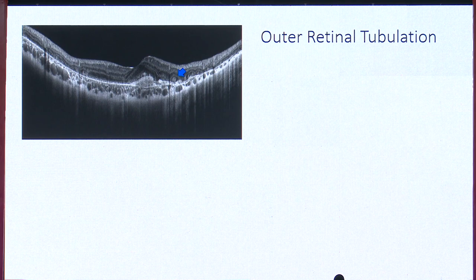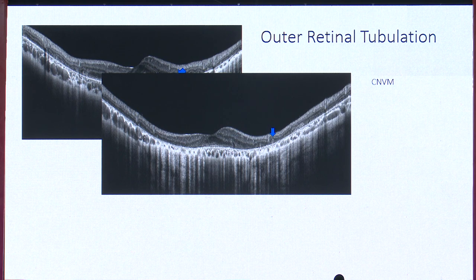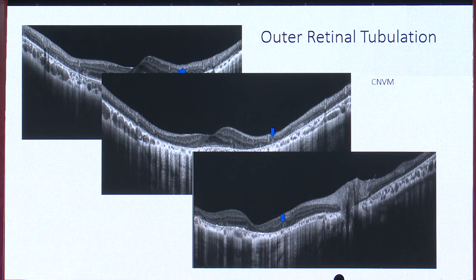Outer retinal tubulations are hyporeflective spaces lined by hyperreflective ELM, mostly described in AMD cases and are a sign of poor visual prognosis, indicating that the photoreceptor layer is lost with degenerating RPE present. They have also been described in other retinal dystrophies and choroideremia — for example, the lower image here is from a Bietti's crystalline dystrophy case.